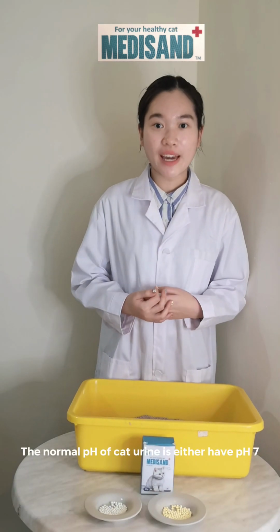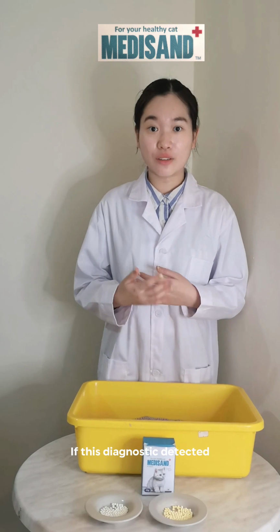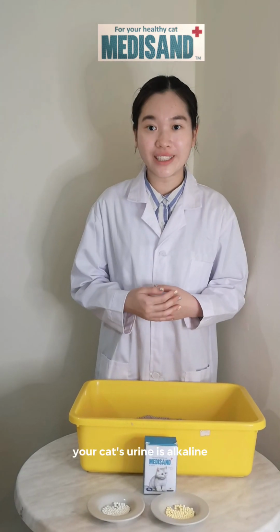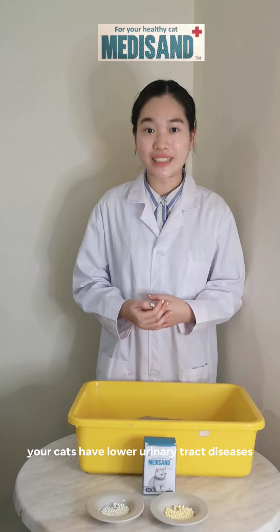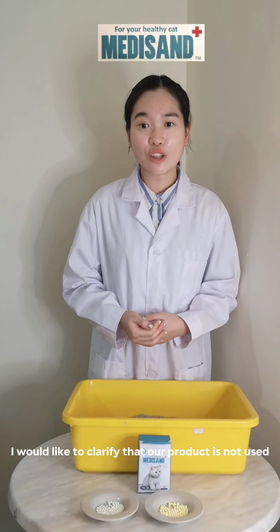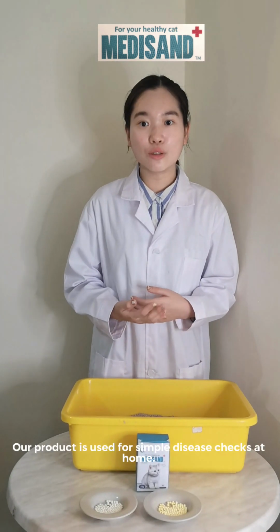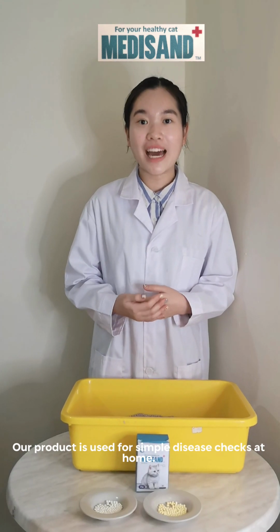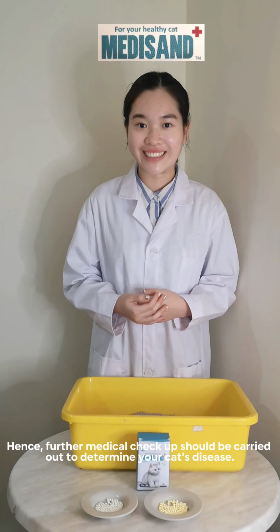The normal pH of cat urine is either pH 7 or weakly acidic. If this diagnostic bead detects that your cat's urine is alkaline, there might be a possibility your cat has lower urinary tract disease or bladder inflammation. I would like to clarify that our product is not used to diagnose any medical conditions of your cats. Our product is used for simple disease checks at home. Hence, further medical checkup with vets should be carried out to determine your cat's disease.